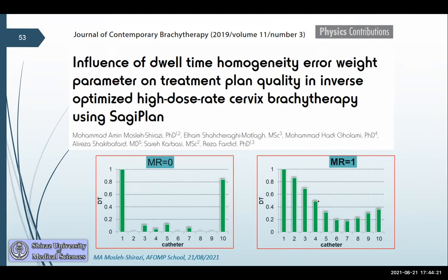There's a sort of low gradient between adjacent dwell positions, and dwell times follow a reasonable gradient. You might have really big peaks next to positions with nothing. This kind of thing can happen.